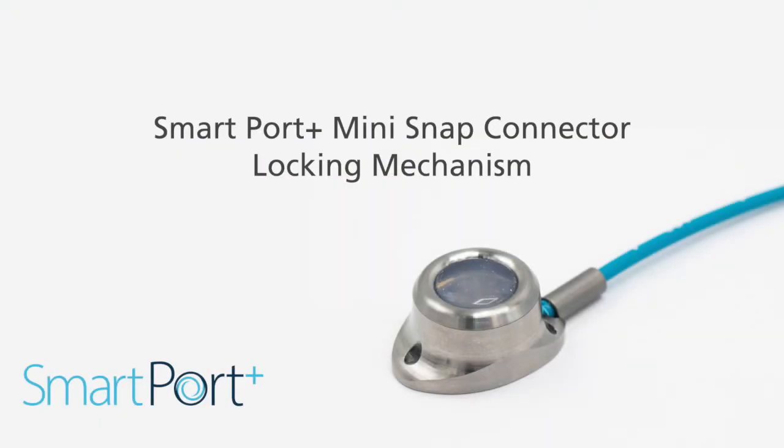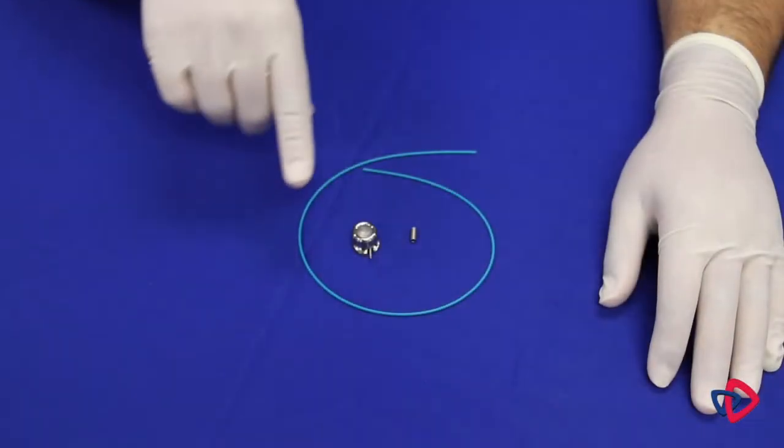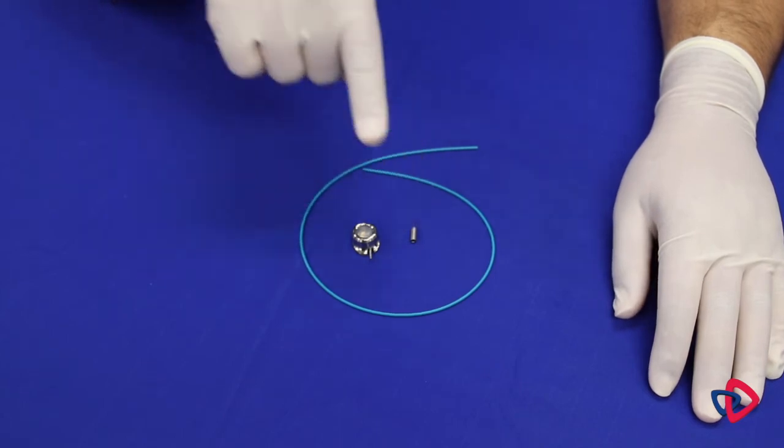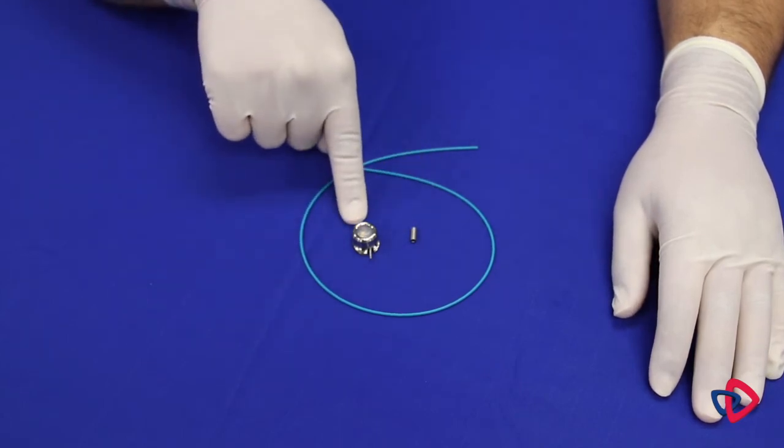In this section, we will cover how to securely connect the port stem and catheter of the SmartPort Plus mini using the snap connector locking mechanism. You will find the catheter, the snap connector locking mechanism, and the port body are located within the procedural tray.